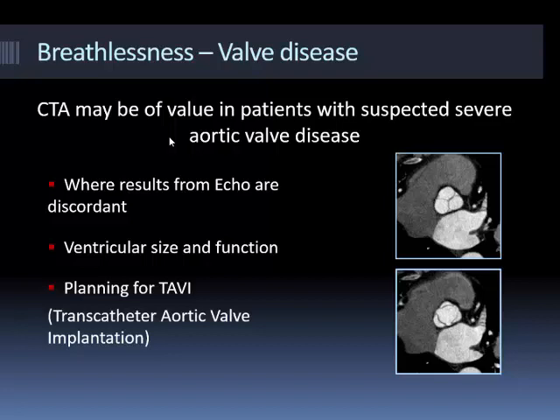Also, because there's a big difference between the blood pool and the myocardium, because you've given contrast, it means that the automated software works much, much better than the MRI. So in other words, you can confidently work out the ejection fraction, you can confidently work out the volumes. Obviously, you can indirectly calculate severity of valve lesions, not that I'm recommending it, by looking at differences in stroke volume between the left and the right heart. You can use a volumetric method to calculate regurg, but clearly echo is going to be the gold standard of that.